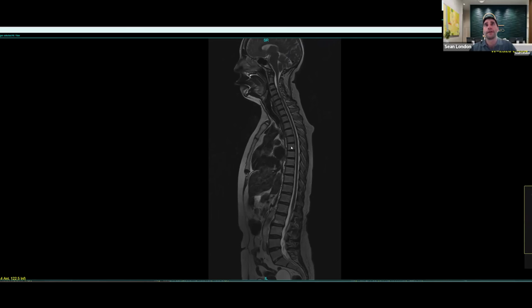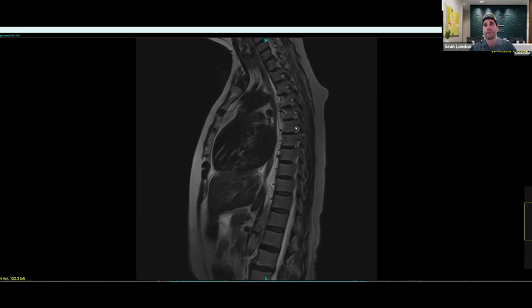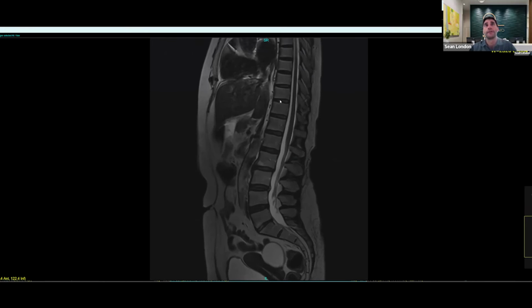The thoracic spine almost looks completely normal, with the exception of some degenerative change within the disc itself called disc desiccation. But I don't see any signs of disc bulging, anything compressing the cord, or anything narrowing the foramina where the nerves exit the spinal cord. And then kind of the same thing in the lumbar spine region. This is the lower region of the spine. There's some disc bulge pushing on the fluid, but there's nothing pinching the nerves that I would think would be symptomatic. So overall, this is a mild degree of degenerative change.